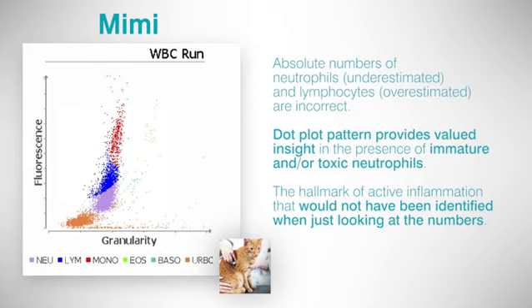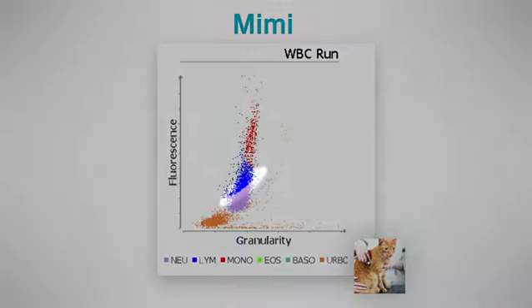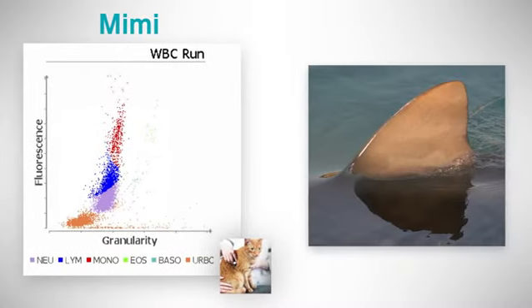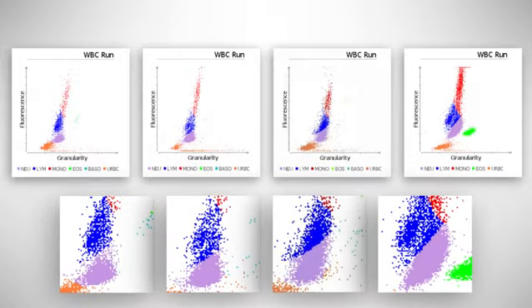The diagonal line that rises to the right between the purple neutrophils and blue lymphocytes is the result of the analyzer's training as to where normal neutrophils and lymphocytes should be located. This particular pattern, which can be seen with moderately severe left shifts, has been nicknamed the shark fin because of the obvious similarities. As the degree of left shift or toxicity becomes more severe, the cluster of neutrophils extends further upward along the fluorescence y-axis, and this pattern may be lost.